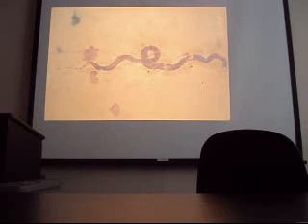We have to do skin snips of this one to find the microfilaria. It's carried by the black fly or buffalo gnat. It's the only one that's not sheath. Onchocercus, not sheath. And the body nuclei do not extend to the tip of the tail. I really don't like that picture.